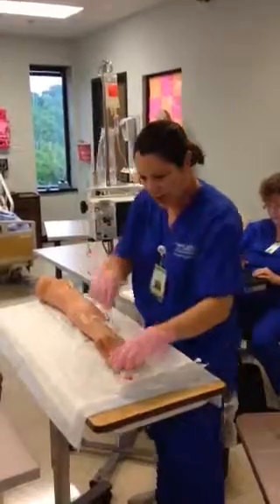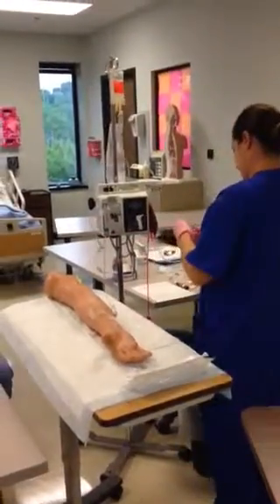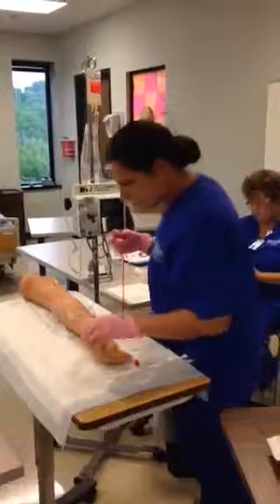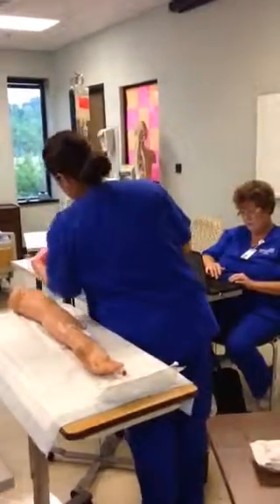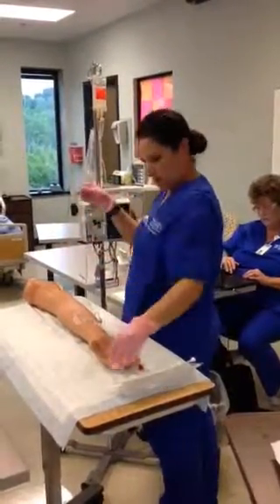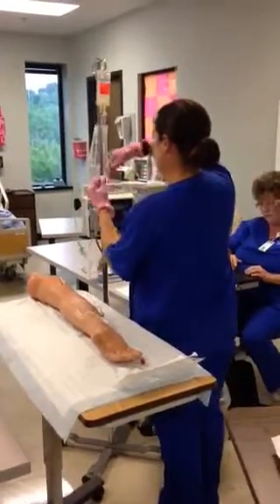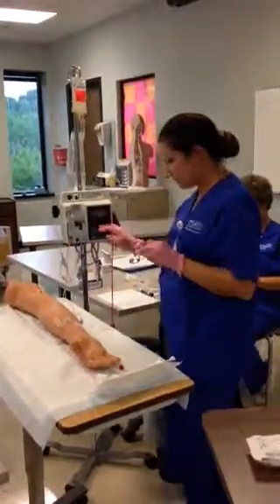I gotta get my roller clamp or my alligator clamp on here. I'm just gonna make sure that I got this. Zero to all the way. And I'm gonna set my pump to 100 mils an hour.